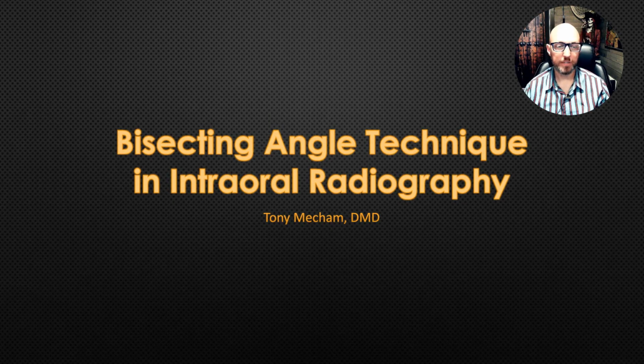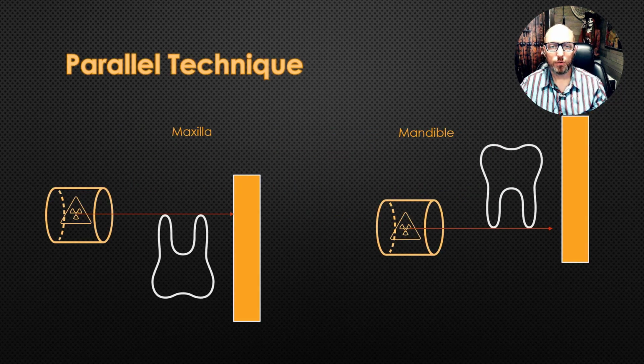Hello again. Based on a video I just made, I wanted to make this video on bisecting angle technique, to explain what it is and to differentiate it from parallel technique, which is the traditional one that's taught in most of the radiology books. So this is what is meant by parallel technique.